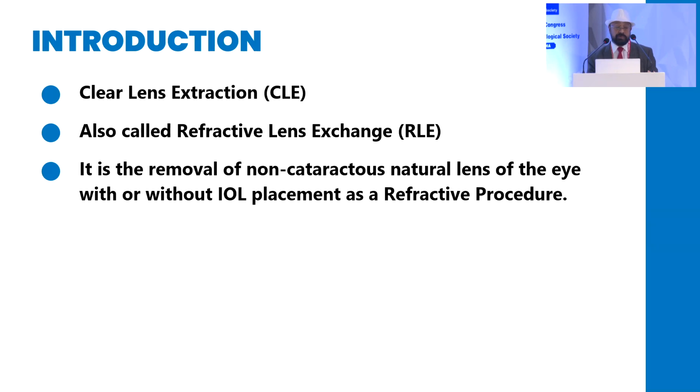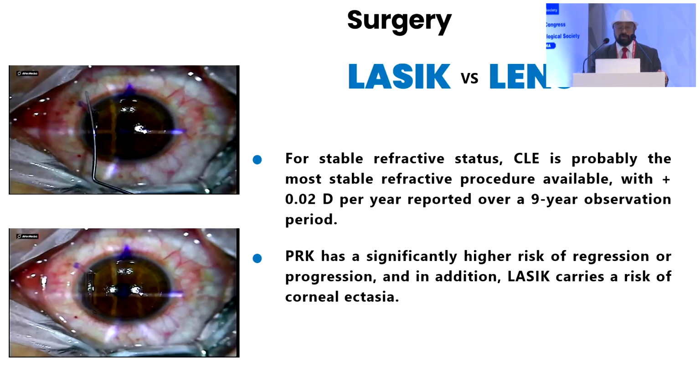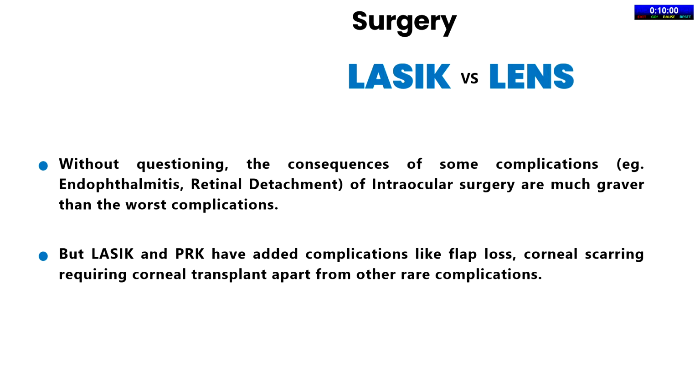Dr. Sujay: The method, people call it CLE, that is clear lens extraction, also known as RLE, that is refractive lens exchange. It is the removal of the non-cataracted lens, where you may put the IOL or you may not put the IOL. There is controversy about LASIK and lens. Let's not talk about it because that is not the subject. There are pros and cons of both of them.